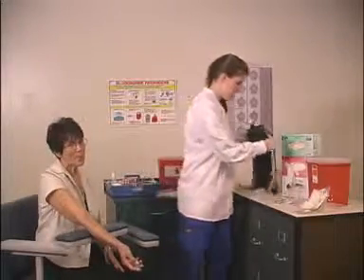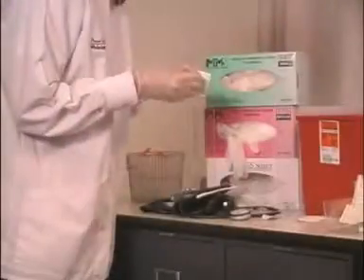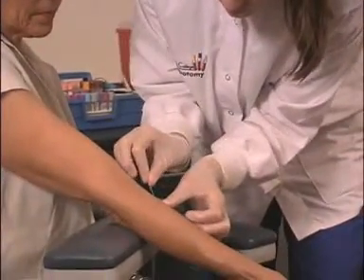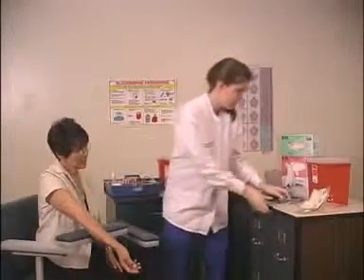Remove the blood pressure cuff, clean the arm, and apply a butterfly bandage or steri-strip. Cover with an adhesive bandage. Instruct the patient not to remove either bandage for 24 hours. The normal duration of this test is approximately 2 to 8 minutes, depending on the method used.